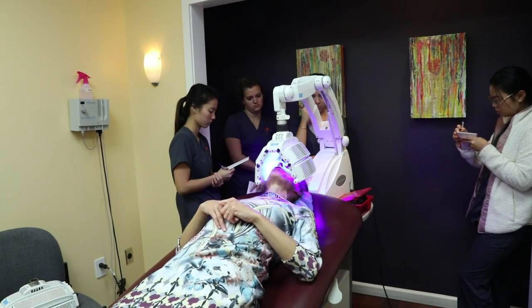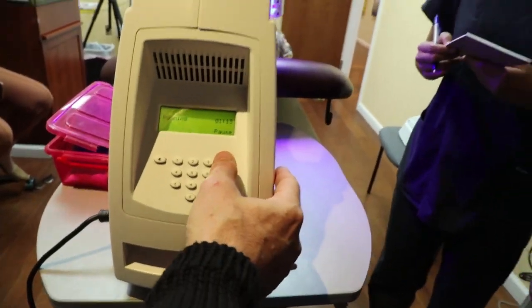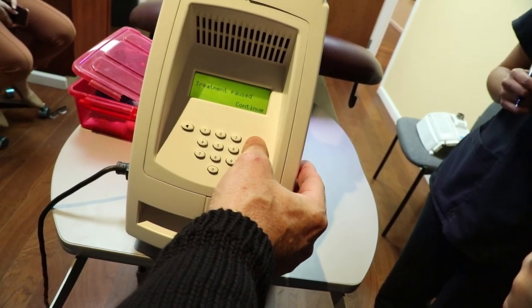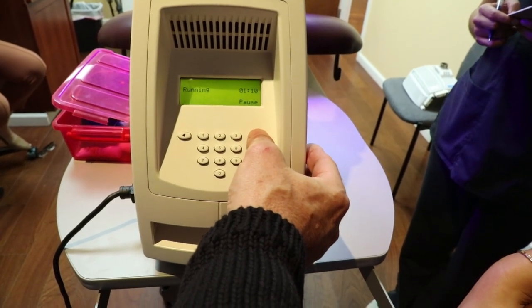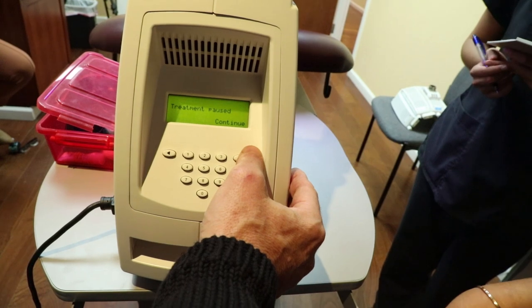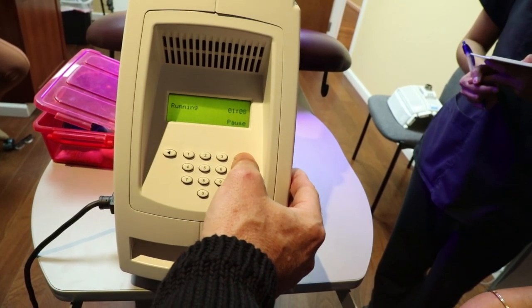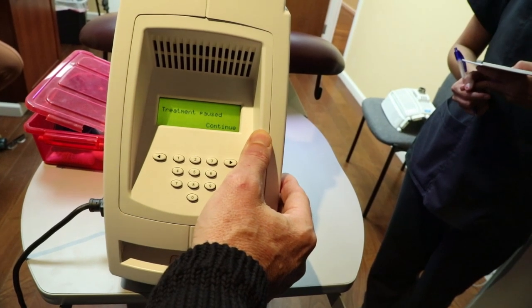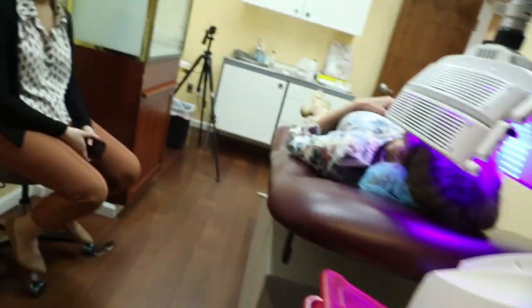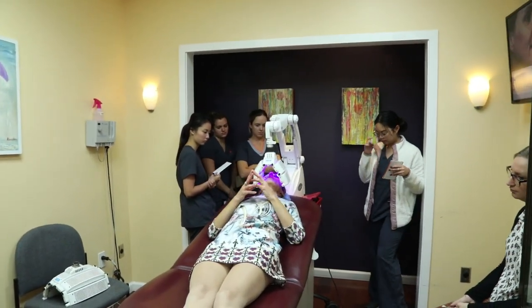There's a pause button — you just pressed it. The pause will instantaneously remove the blue light activation. Sometimes we hand the patient a fan. It's not perfect because we don't want the warmth of the skin to turn really cold — then the activation is not going to be as good. But a little bit of something helps more than not doing anything.